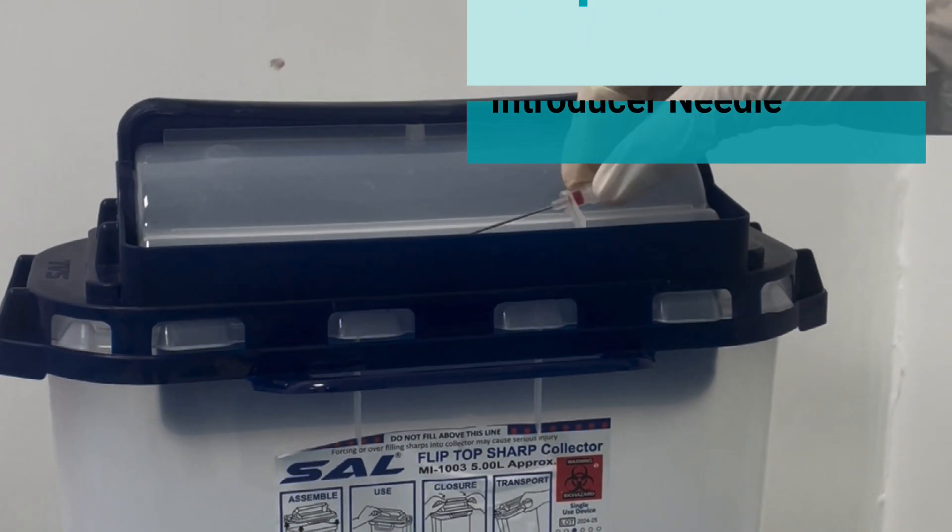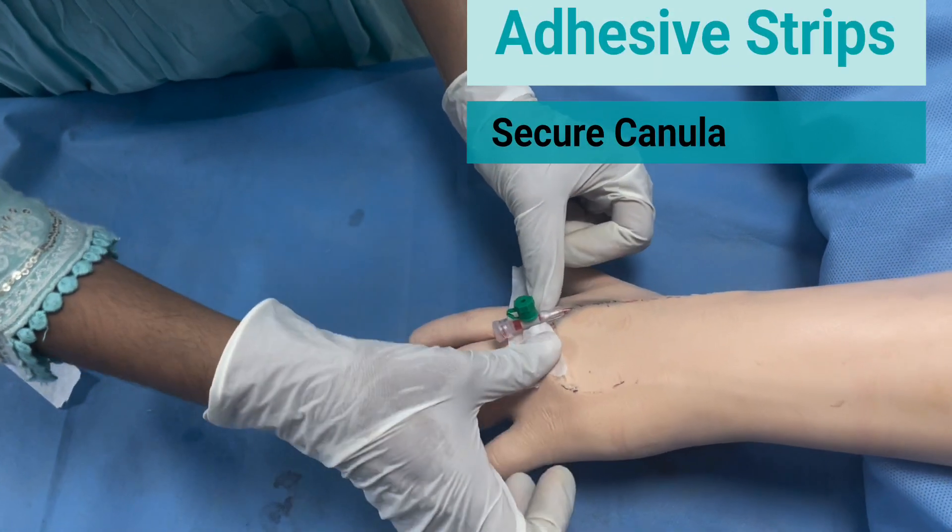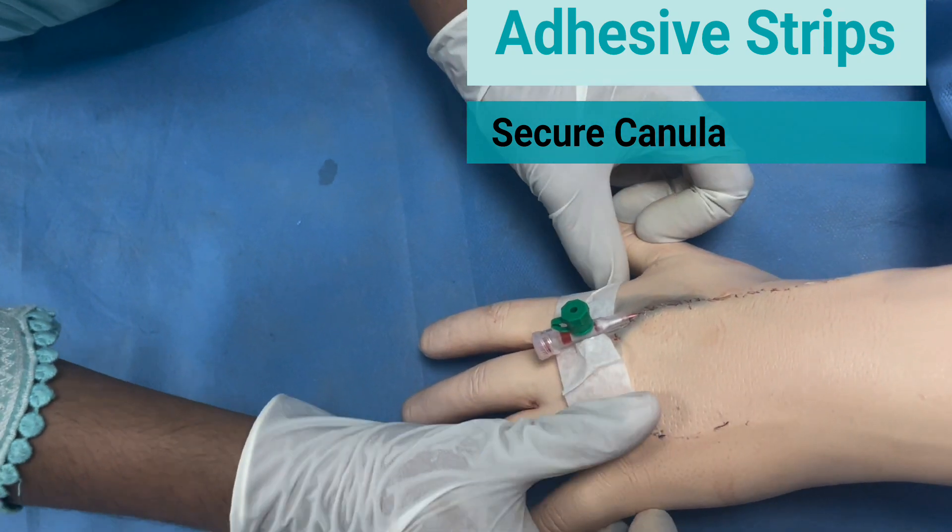Dispose of the introducer needle. Secure the cannula using adhesive strips.